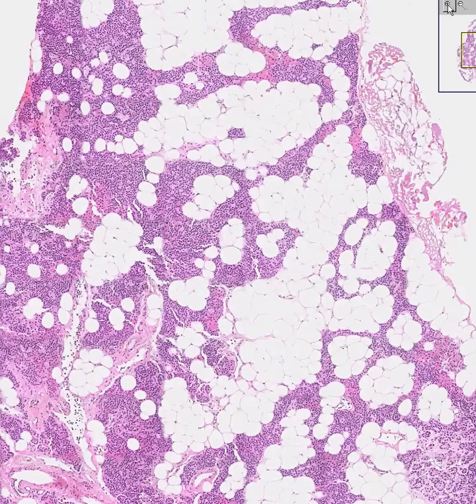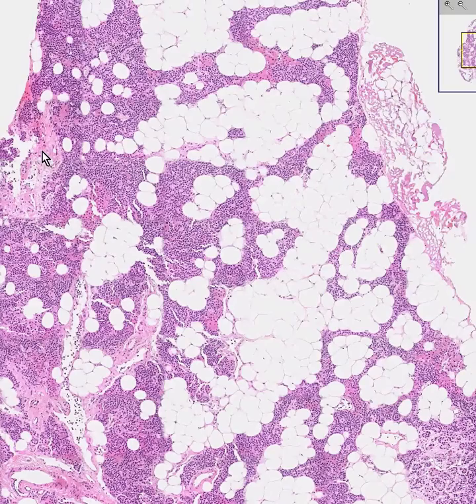The parathyroid gland, besides having a nice fibrous capsule, which you can see here, and a little bit of fibrous tissue, as well as fat and blood vessels, has two kinds of cells.